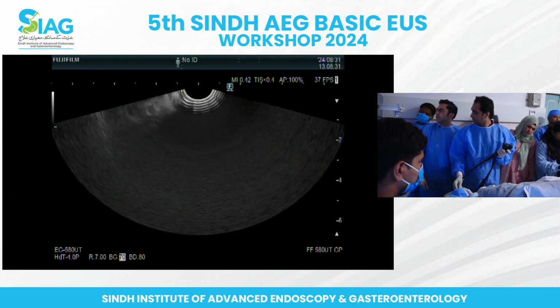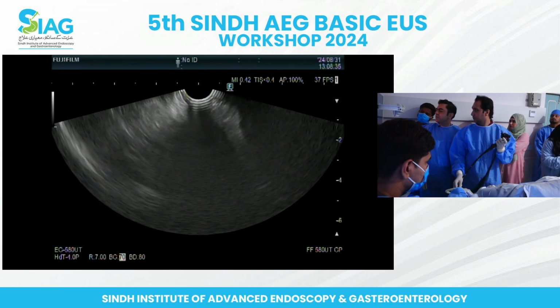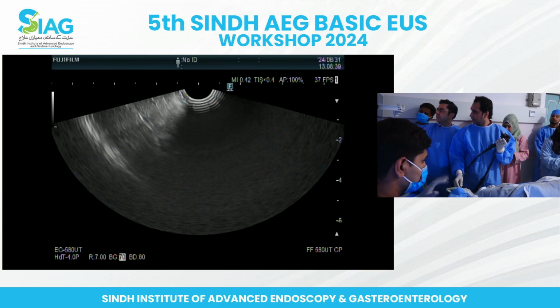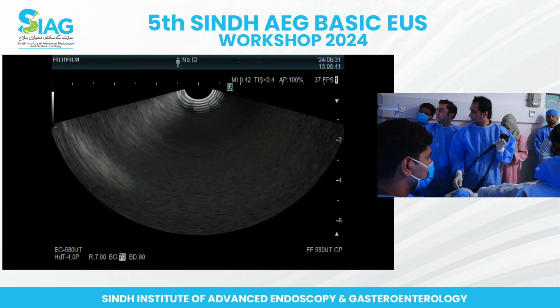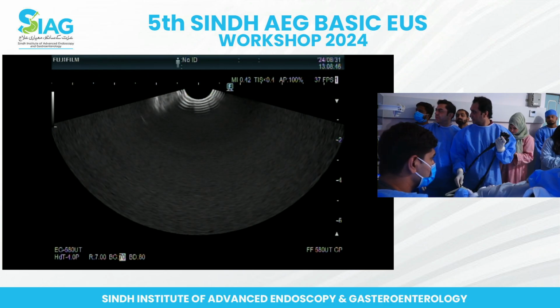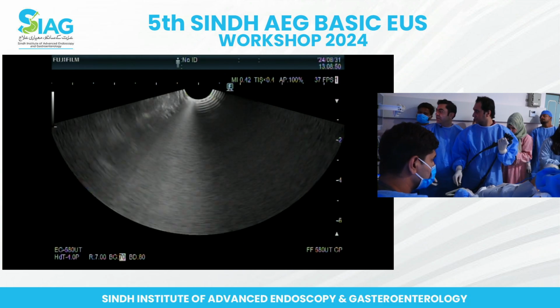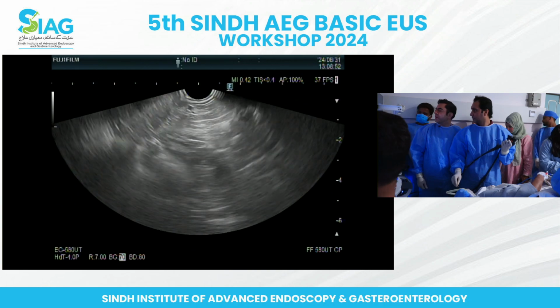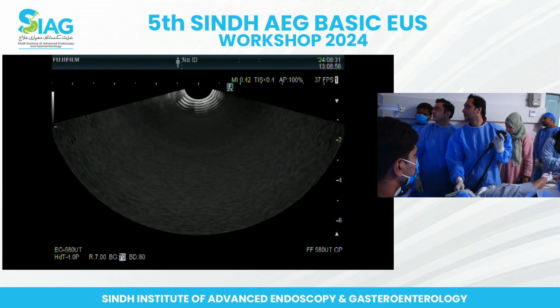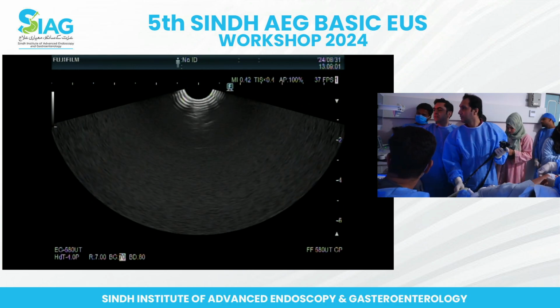I'm in the stomach. I don't know. If you just pull back slightly, I think you are still in the duodenum, but just fill some air in so that you can see where you are. I think I'm in the stomach because I'm at 60. No, I think you're not. So just pull back. And now pull in air and then go again, like you did last time. Yes, that's okay. Excellent. Now it's very clear, isn't it? Just stop there for a second.